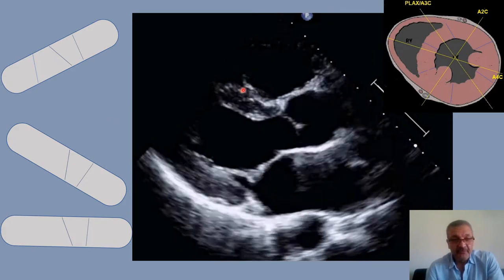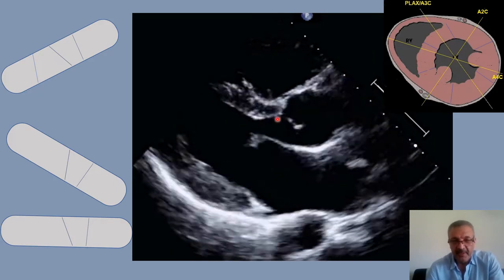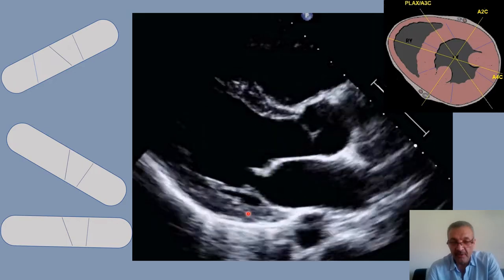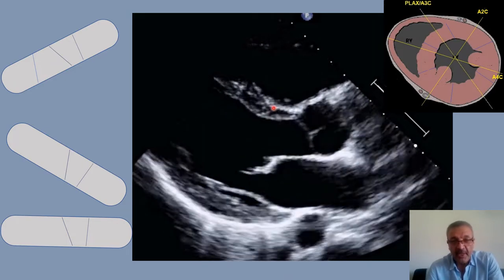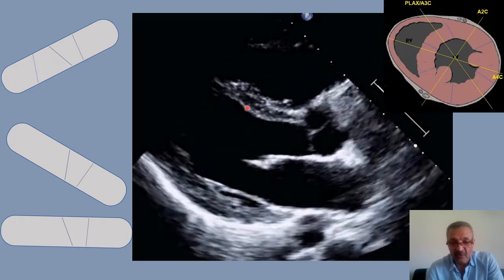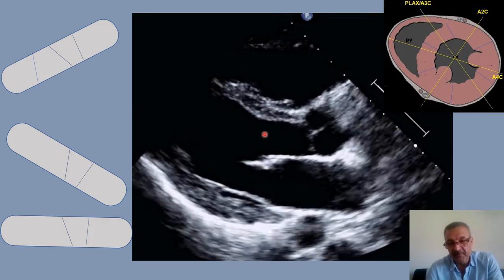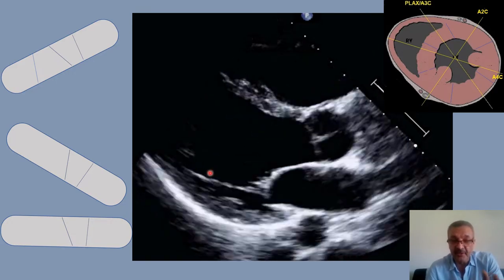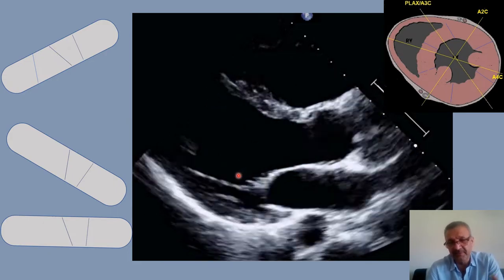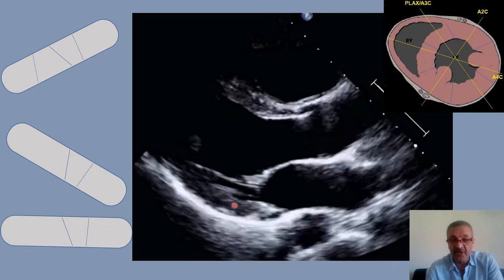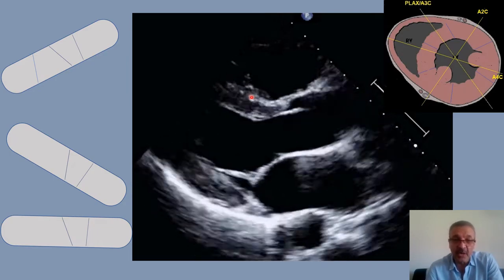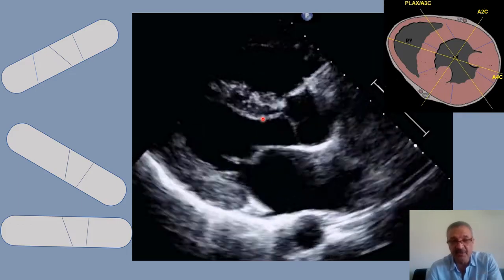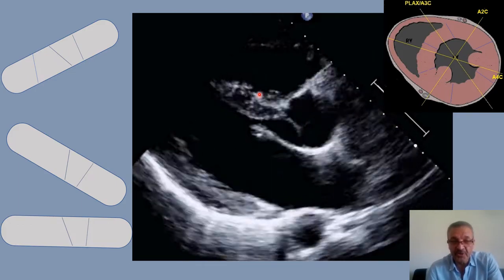Another tip: in normal people, the septal wall thickness is almost the same as the posterior wall — it's symmetric. So when measuring, always check your numbers. If they are not the same, ask yourself if you're measuring correctly. Sometimes we have localized hypertrophy, but this is rare. It could be a mass, infarction, or a segment that is thin or thickened. Verify by checking other views, such as apical or PSAX.